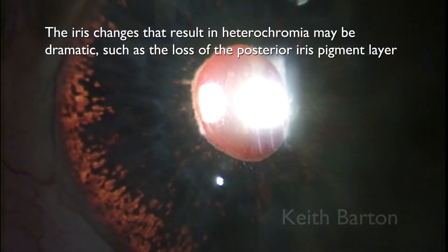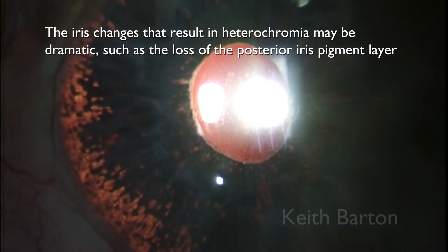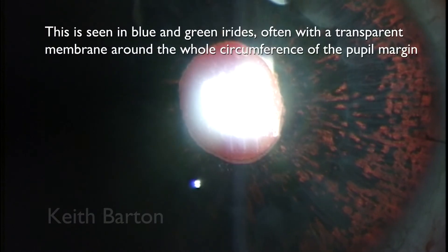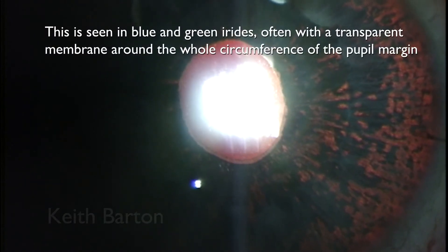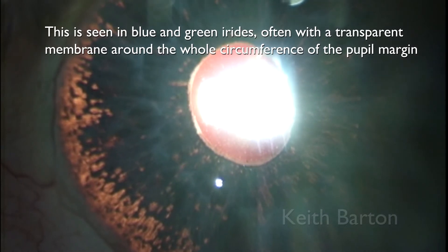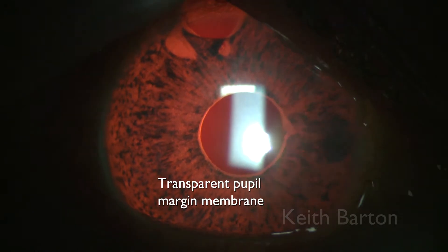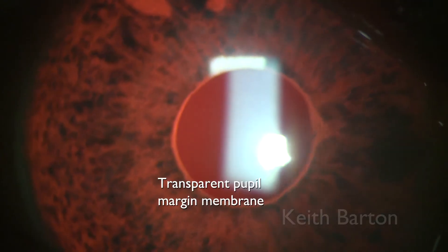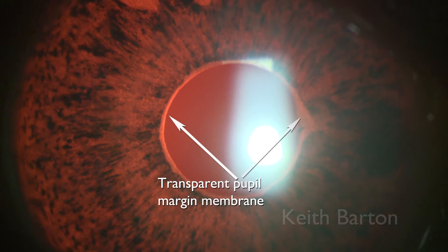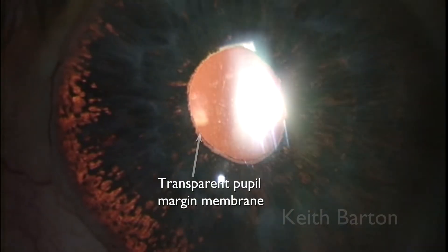The iris changes that result in heterochromia may be dramatic, such as the loss of the posterior iris pigment layer. This is seen in blue and green irides, often with a transparent membrane around the whole circumference of the pupil margin, as can be seen in this case and again here.